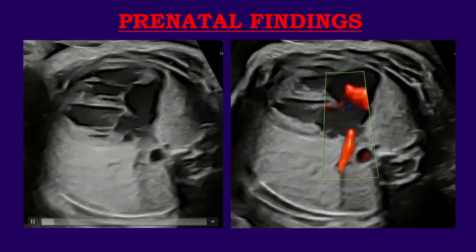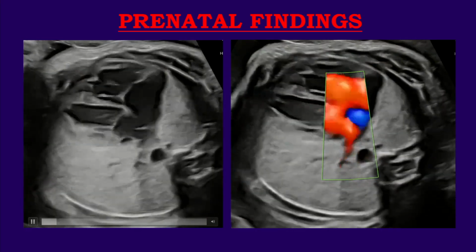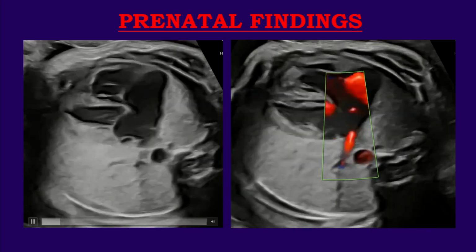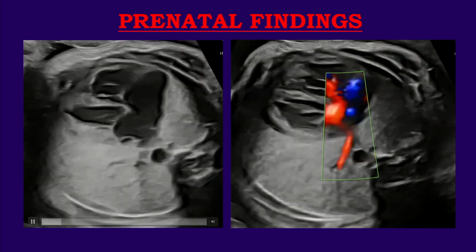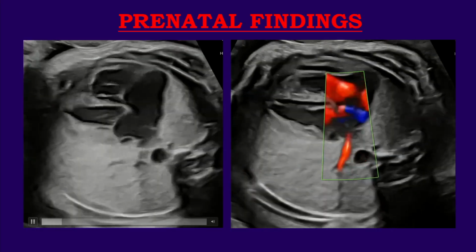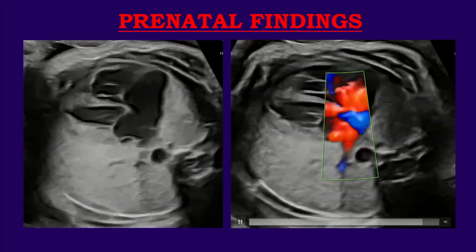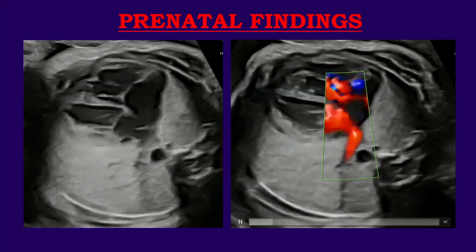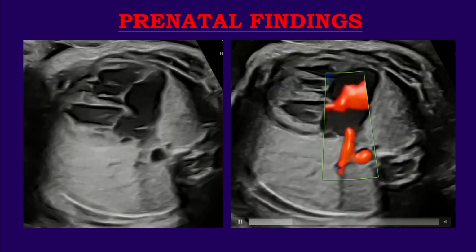Well, so can you see any masses in this lung? No, we were able to see on the situs view in the upper abdominal level that the stomach is in there and the liver in the correct position. So you may ask, well, the angle of the color box, the size of the color box is too narrow. You're probably not catching something from the right lung.